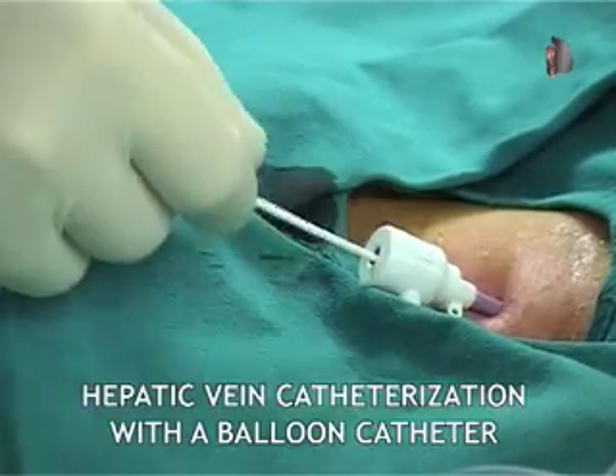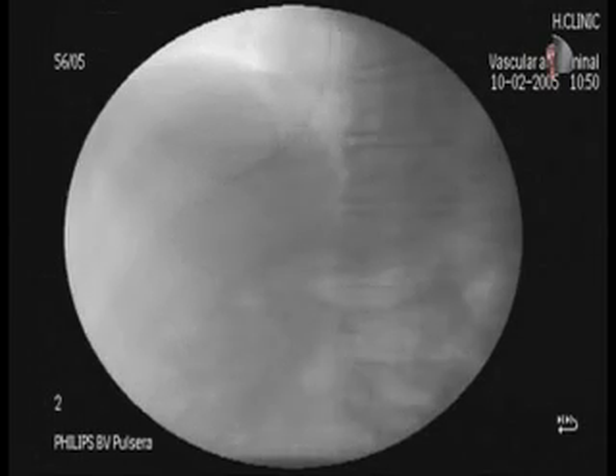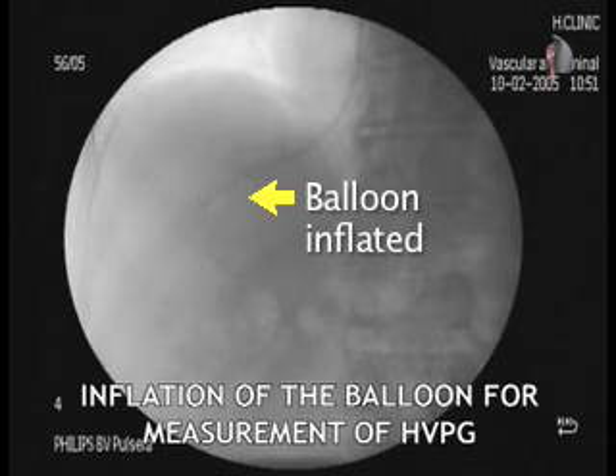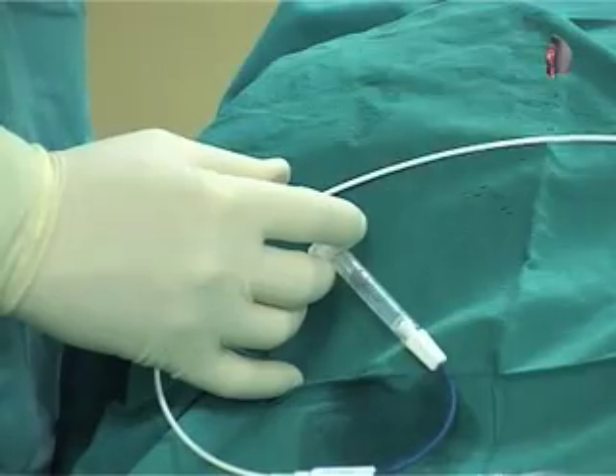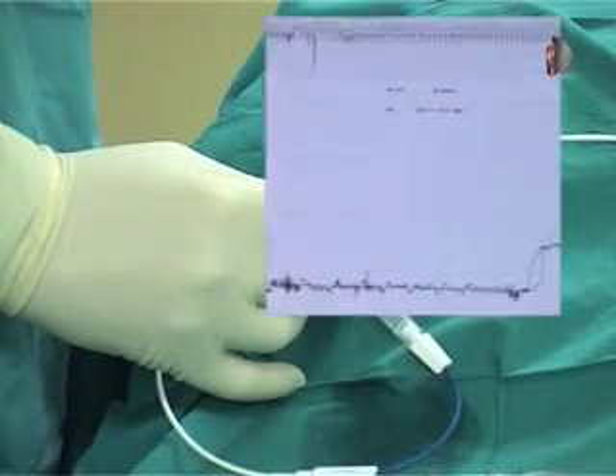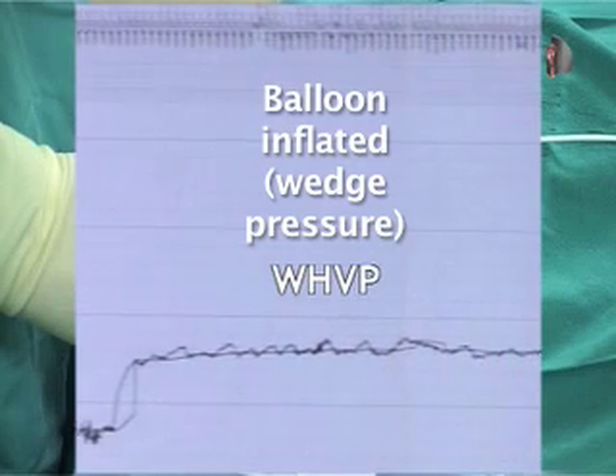The balloon-tipped catheter is advanced into the right hepatic vein. Adequate occlusion of the hepatic vein is confirmed by inflation of the balloon and dye injection. Pressures are recorded when the balloon is deflated and when it is inflated.